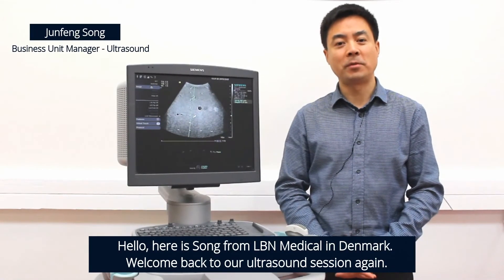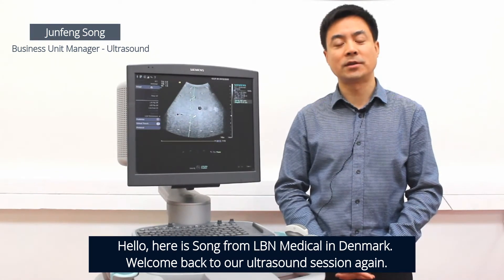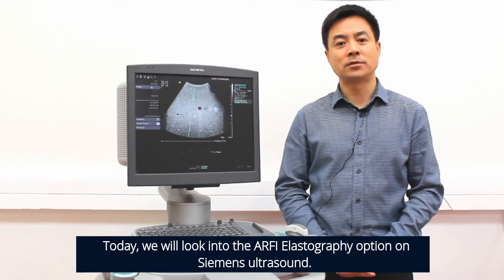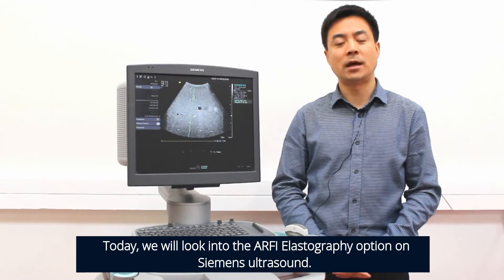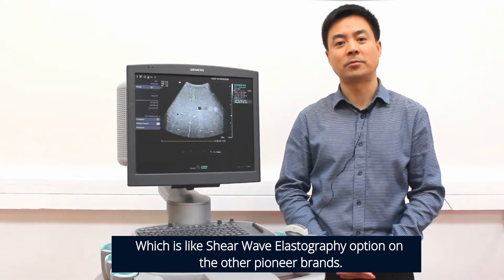Hello, here is Song from LBN Medical in Denmark. Welcome back to our ultrasound session again. Today we'll look into the ARFI elastography option on Siemens ultrasound, which is like shear wave elastography option on the other Pioneer brands.